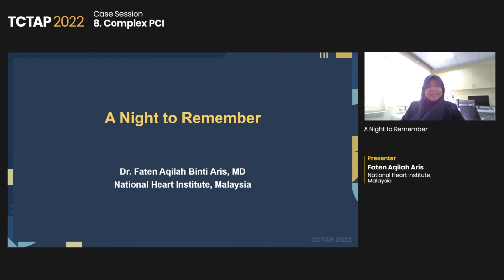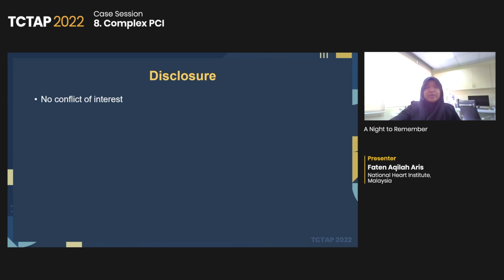I'm going to present a case, A Night to Remember. It's a case of inferior MI which I encountered during one of my on-calls recently. So I'll begin my presentation. I have no conflict of interest.